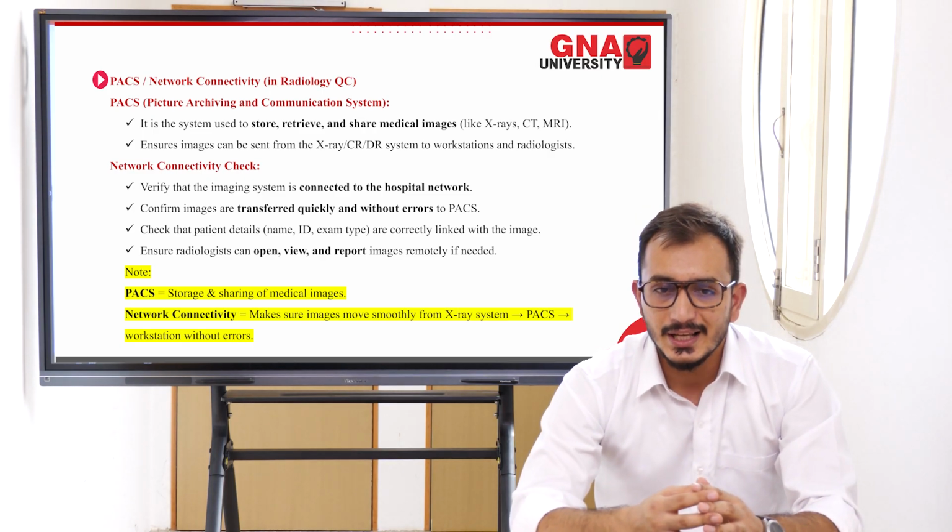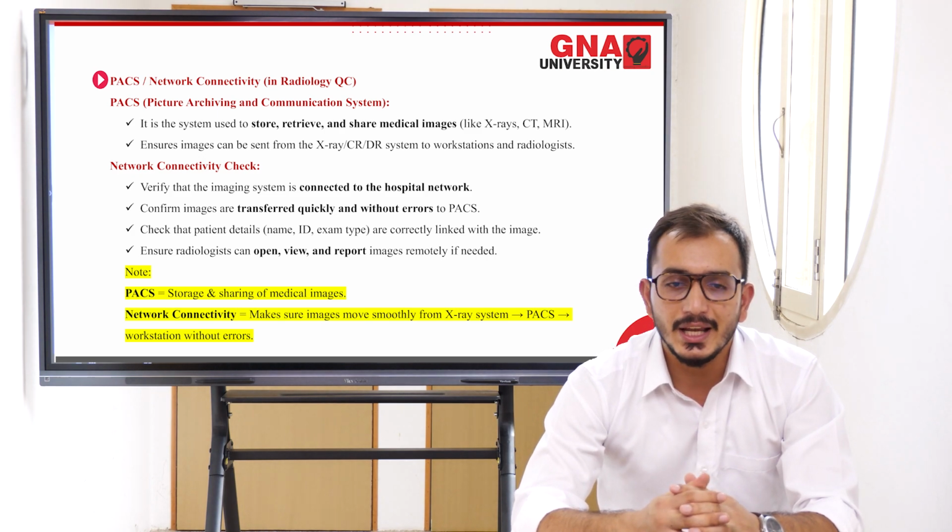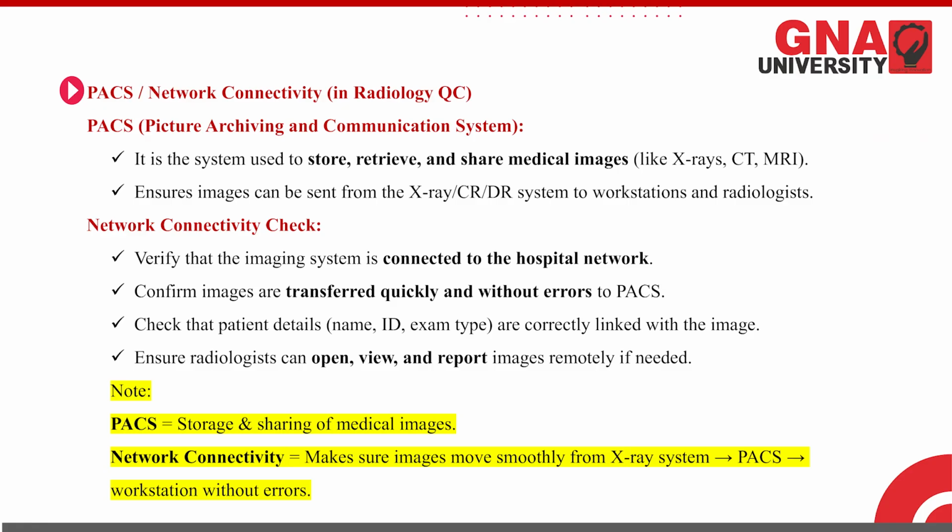And the next thing is related to PACS, which is network connectivity in radiology. We call it the Picture Archiving and Communication System, and it is a system used to store, retrieve and share medical images.